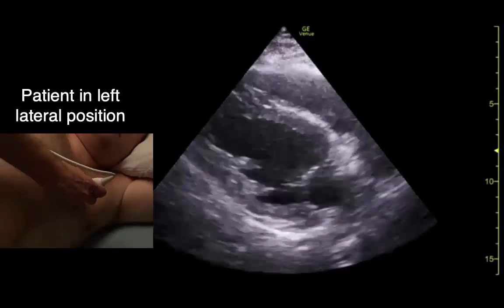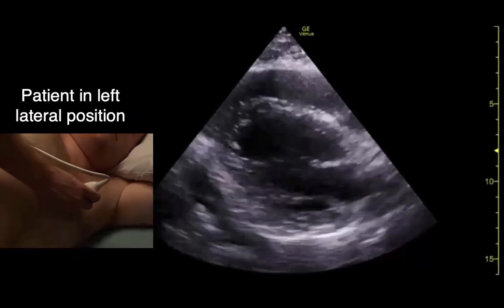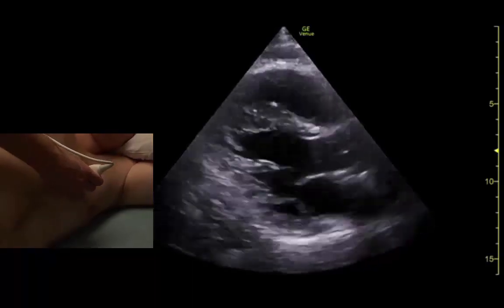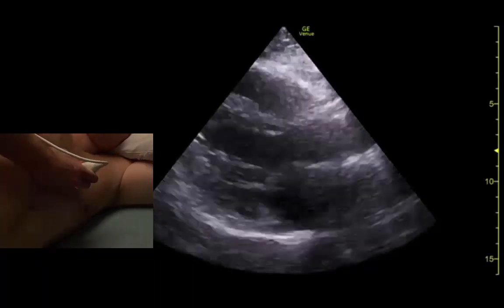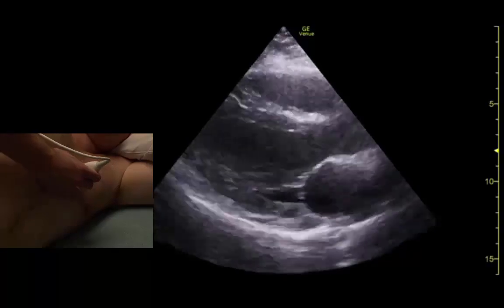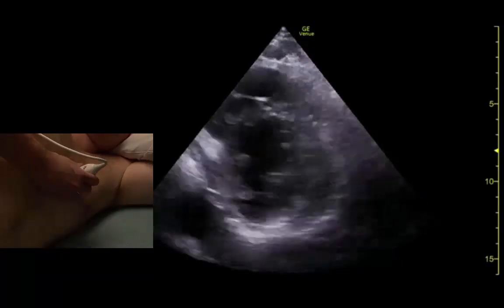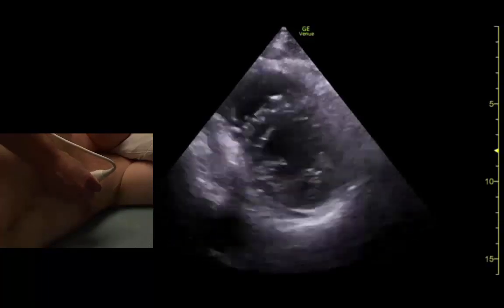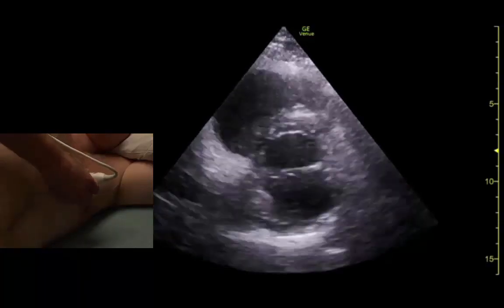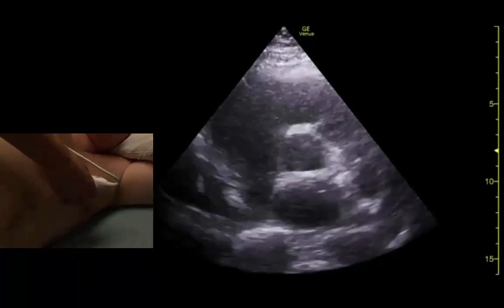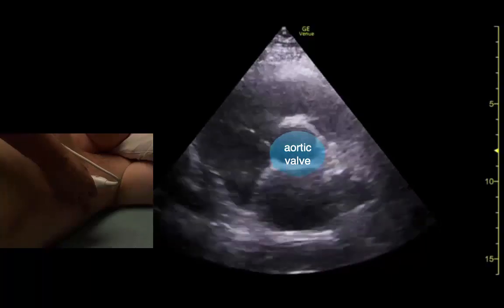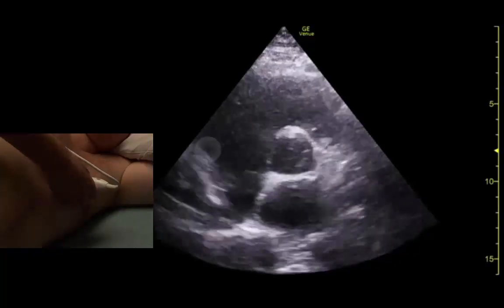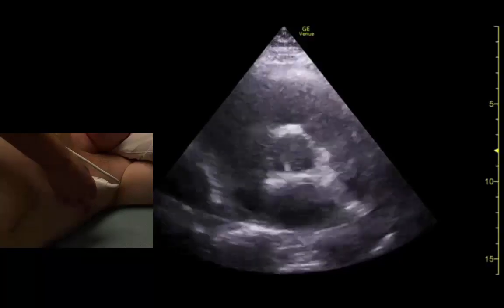We can always get prettier parasternal views by adjusting the probe position. Here is a better aortic valve view, and on the sides of the aortic valve we see the tricuspid and pulmonic valves.